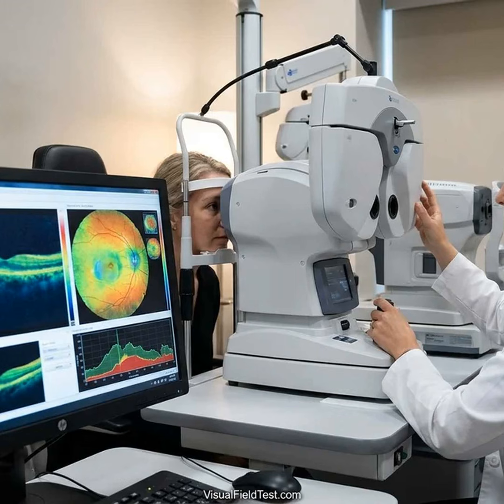Macular ganglion cell changes. Because moderate glaucoma can begin to affect central vision, doctors also review the macular scans. Thinning of the ganglion cell layer in the macula, shown on the GCC or GCIPL map, can confirm that the damage is real and spreading. Sometimes a subtle macular change on OCT will appear even if peripheral field loss is mild.